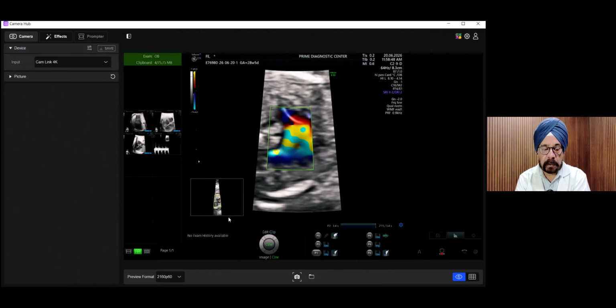The cutoff for calling it abnormal, as I told you, is that the RV should be 60% larger than the LV, or the ratio should be more than 1.6. Below that, you can know this is a normal phenomenon. We've documented almost everything. The Doppler parameters were fine. There was no AV malformation anywhere. There was no ductal restriction, which we saw.